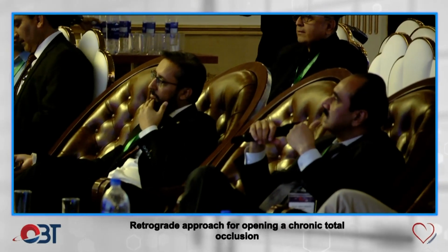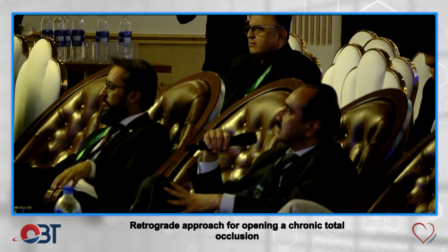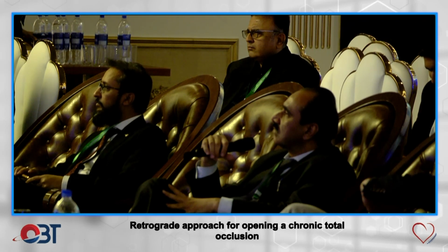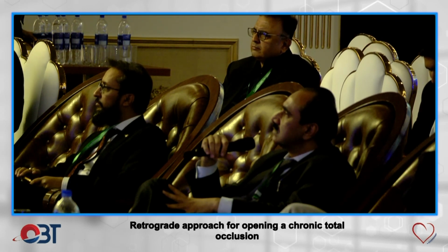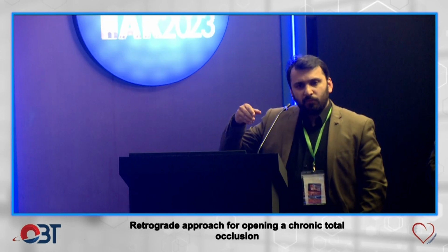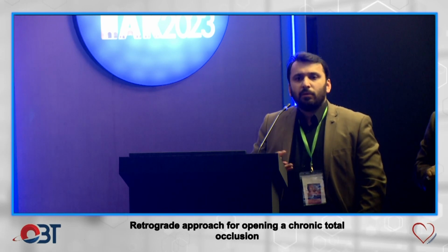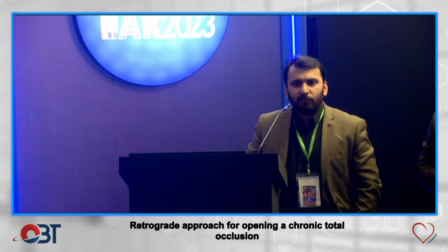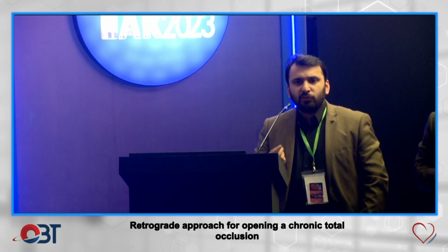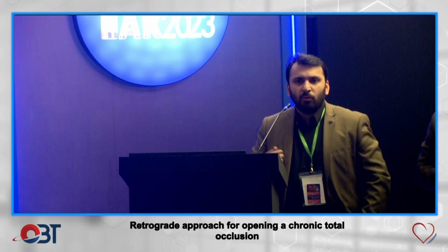You started after trying one or two wires, sir, where you ultimately went into the retrograde. The Gaia wire was attempted with the Fine Cross, but the Pilot 200 wire was attempted without taking the microcatheter. To track the Gaia wire up to the plaque, the microcatheter was used to replace the Pilot 200 with the Gaia wire. But that is just to replace the wire, because the microcatheter usually does not add much to the features of the wire. The wire makes its way by its own.